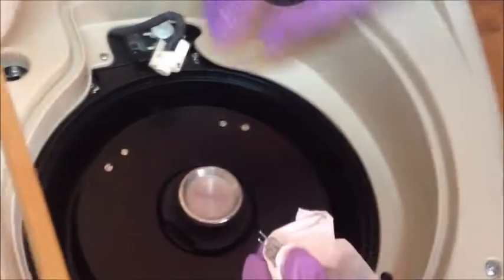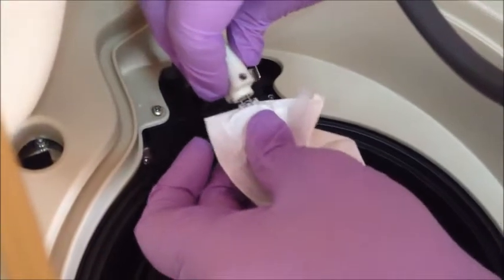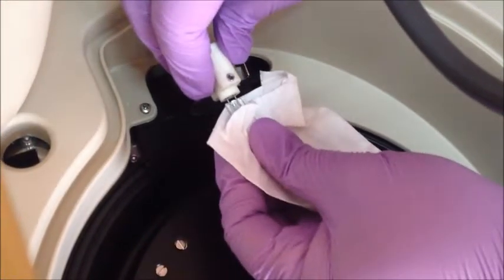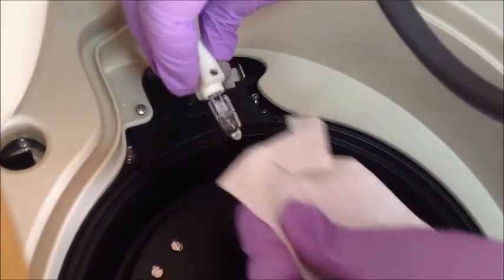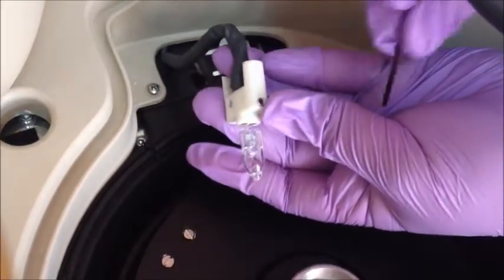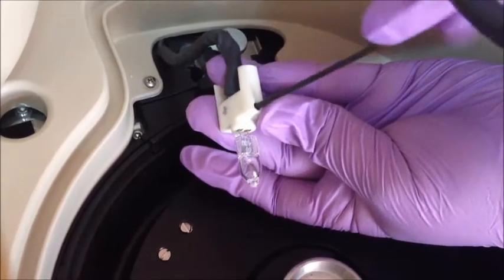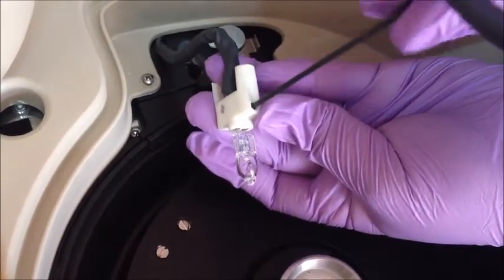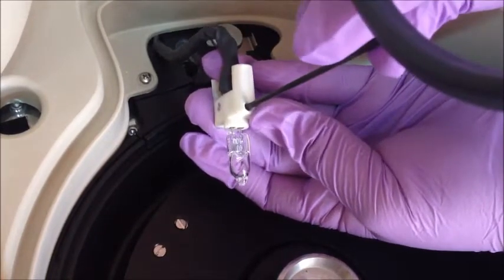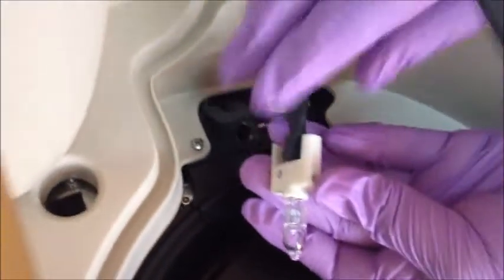Put the new lamp in the holder and fix it by tightening the screws in place. Then place it back in the optical group.